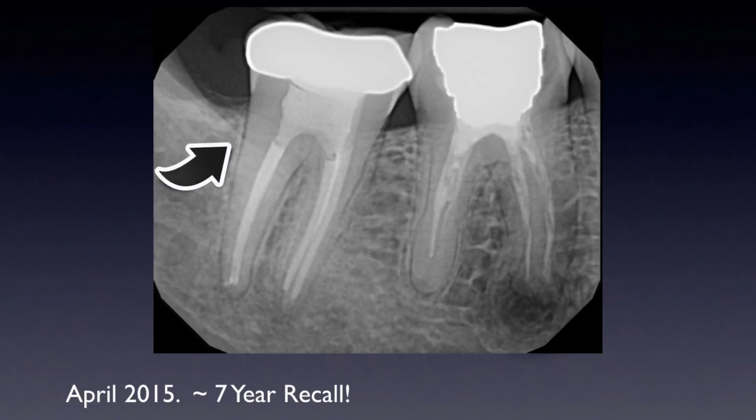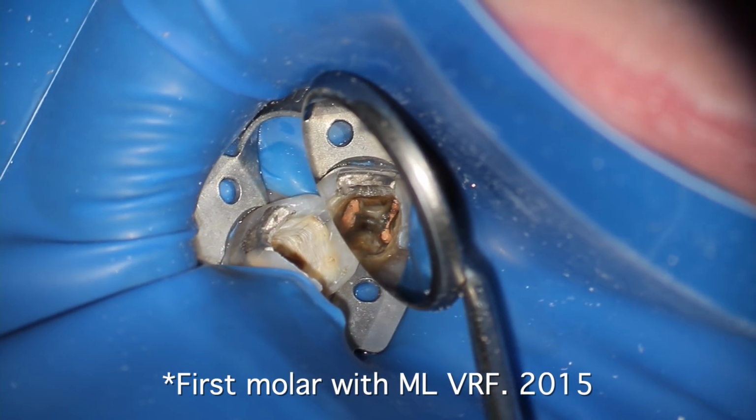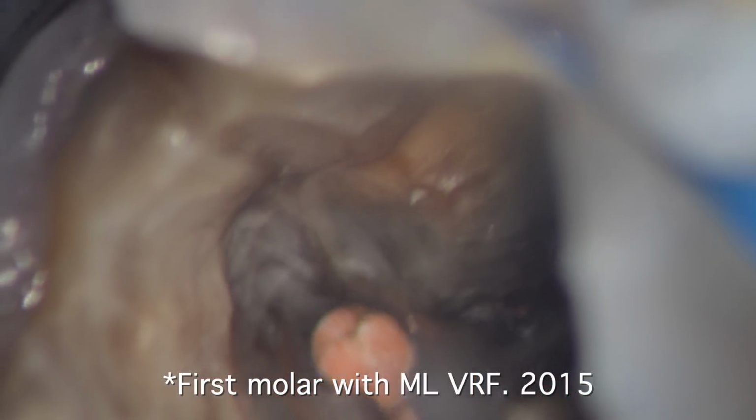The radiolucency in the first molar was still obviously there since it wasn't retreated, but unfortunately when we attempted to retreat this tooth, a long vertical root fracture was found in the mesiolingual aspect of this first molar, and the tooth was deemed a poor risk for a restoration, and was then referred for extraction.